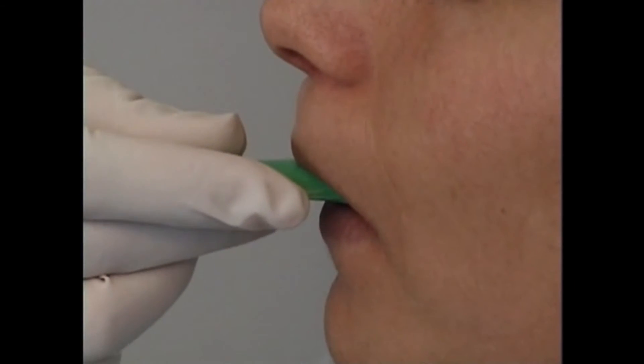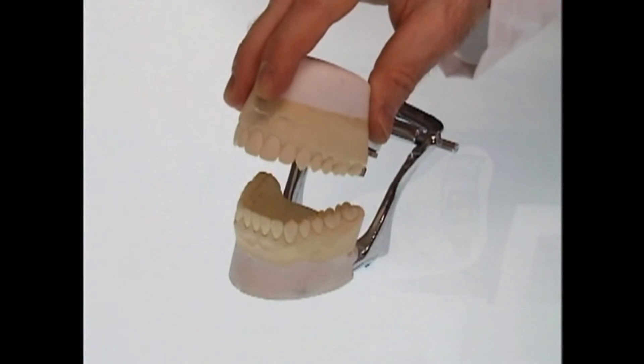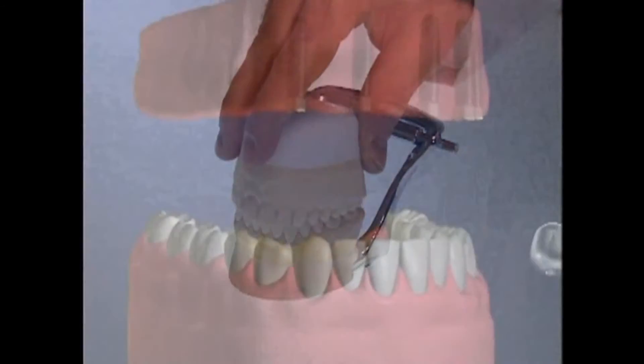Though some of the steps might be different in your case, they usually include making impressions of your mouth. From these impressions, we make precise working models of your mouth which are carefully mounted for proper alignment.